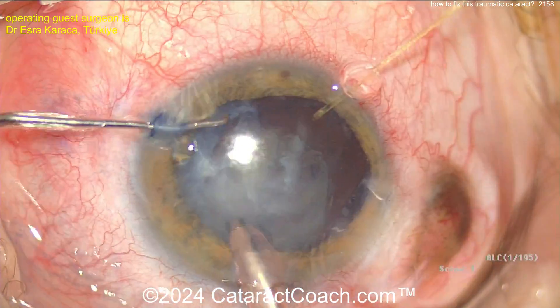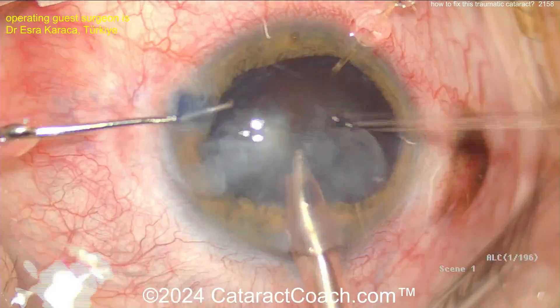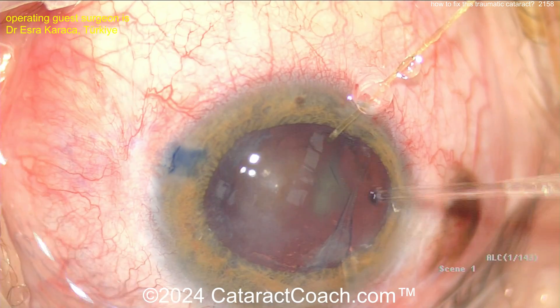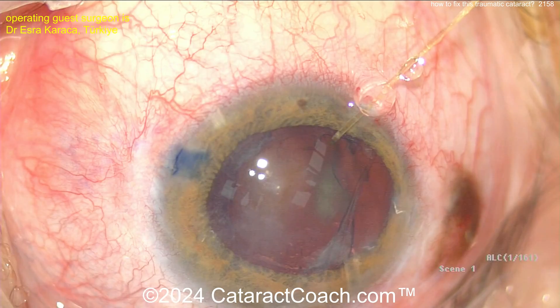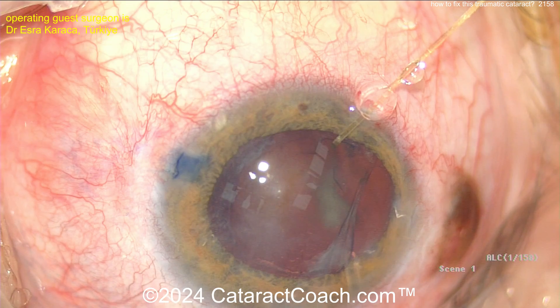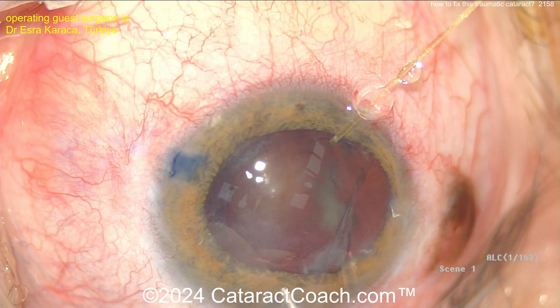Not a very dense cataract. I like the idea of putting in more viscoelastic — that's smart, very smart. And now taking out the cataract, coming up pretty easily. So not too dense of a cataract, which is good. Be careful coming out of the eye here, because when you let the AC collapse, you get more vitreous prolapse. You may want to check again to see if you have more vitreous being prolapsed.